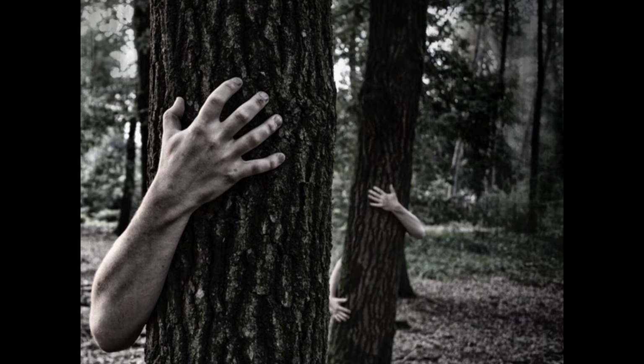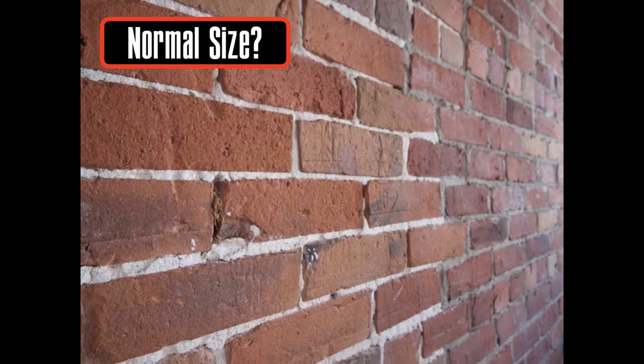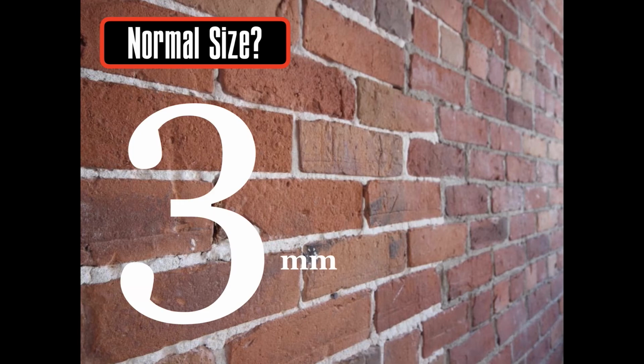So there are 5 parameters to the gallbladder ultrasound that we are looking for when we do these tests. The first of which is the size of the wall of the gallbladder, or how thick the wall is. What is a normal gallbladder wall? Give you a second to think about it. You want to be less than 3 millimeters. That's going to be a normal gallbladder wall thickness, 3 or less.